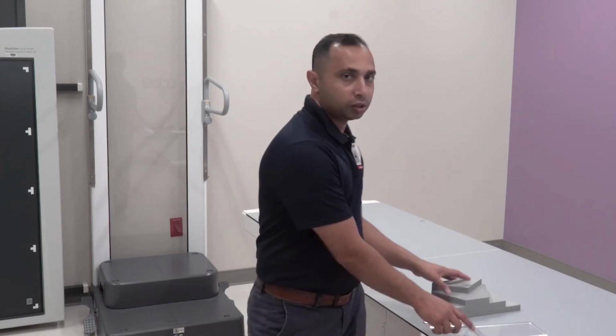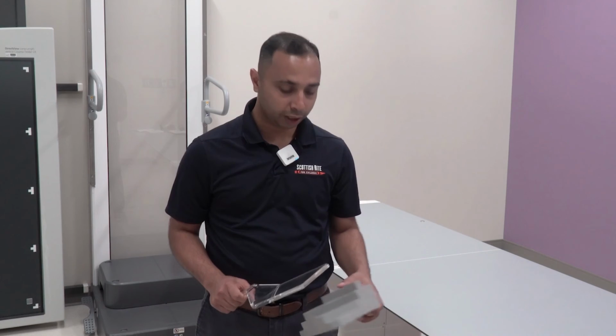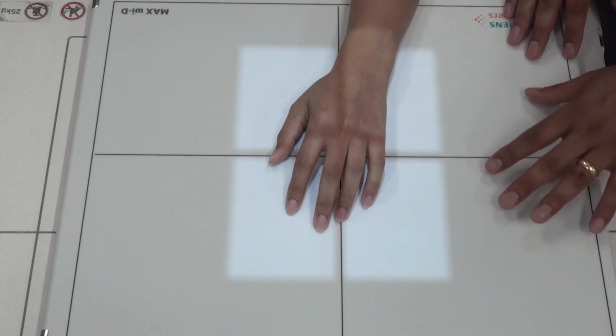So now let's take a look at positioning for our hand and finger x-rays. We use special tools like the hand spatula and a radiolucent sponge to help with positioning our patients. When positioning for a PA hand view, it's really important to get the hands as flat on the detector as possible. A lot of times the patients come in and because of pain or stiffness, they tend to curl their fingers. So there's 2 ways to get the hand as straight as possible.